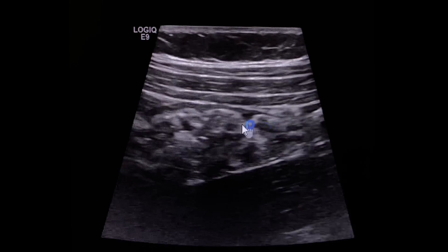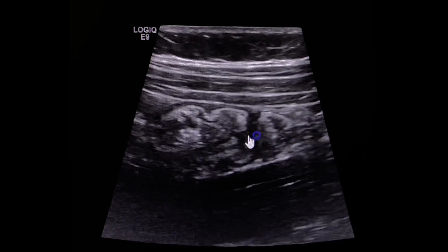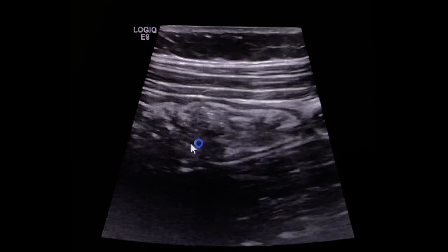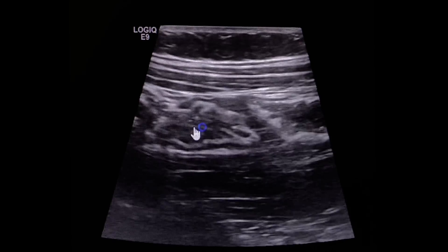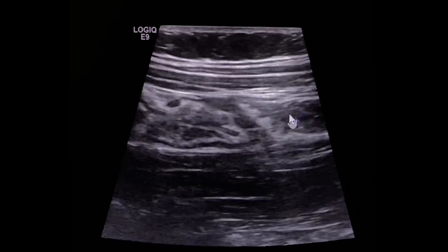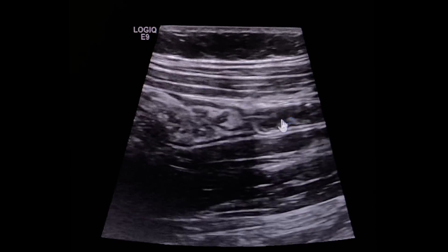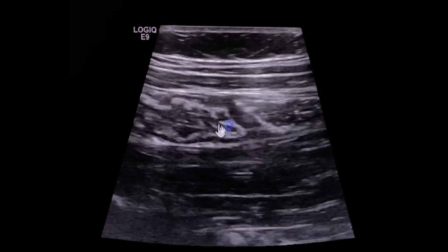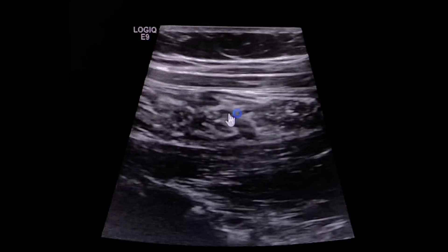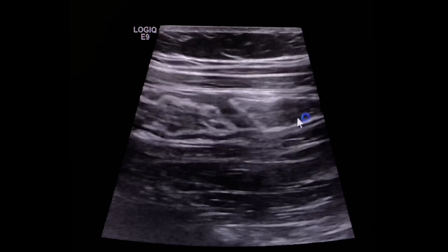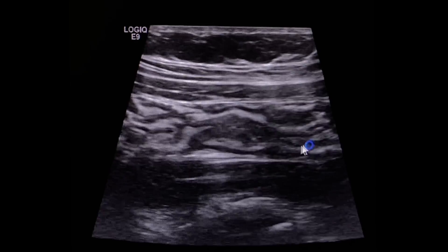And then this is the cecum or the beginning of the ascending colon. So psoas muscle here, cecum and ileum. So if this is the ileum going into the cecum, this would be the ileocecal valve or ileocecal junction. And this would be the terminal ileum.